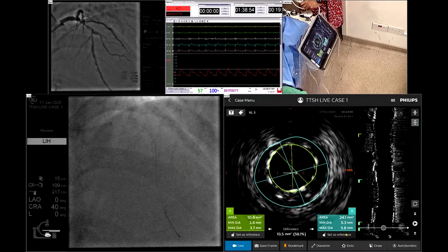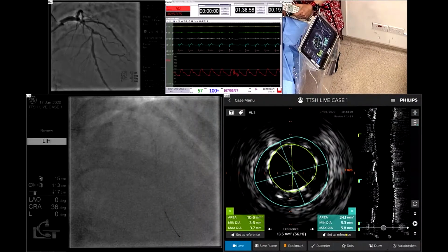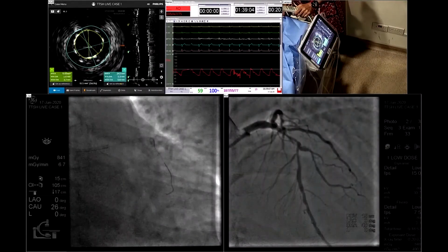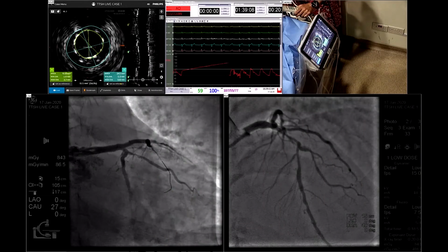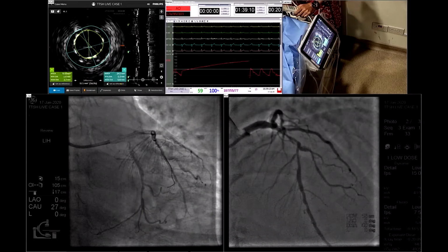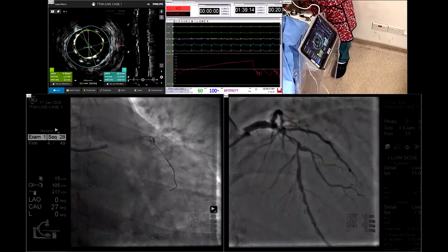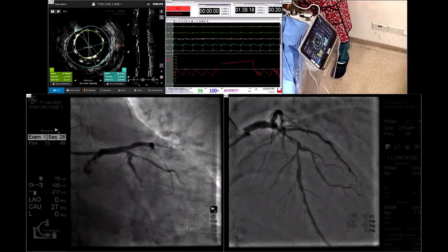Can I give you another picture of AP caudal? Deborah, can you get an AP caudal picture for me? I would probably leave this, Paul. I think you've done a great job and measured the physiology. We've seen lots of cases like this whereby you can further optimize if the physiology is not where you thought it would be, and maybe that's a good guide. But otherwise, from an IVUS perspective, it's solid. Yeah. Can you go back control for me?